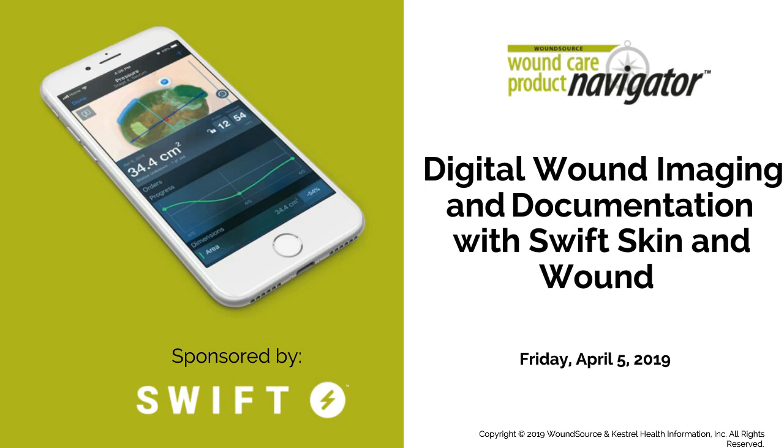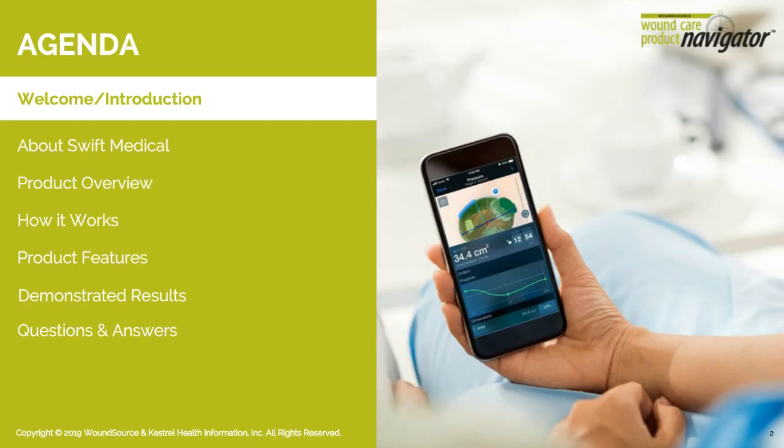My name is Emmy McCauley from WoundSource, and I will be the moderator for this event. This program will provide an in-depth look into Swift Medical's digital wound imaging and documentation solution, providing information on the features and benefits of Swift Skin and Wound, as well as a live product demonstration. This presentation will be followed by a question and answer session, so we encourage you to submit your questions to us throughout the program.